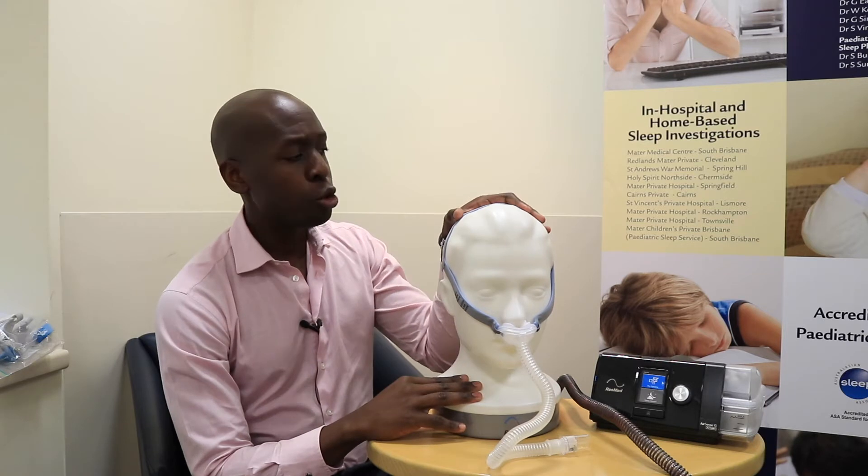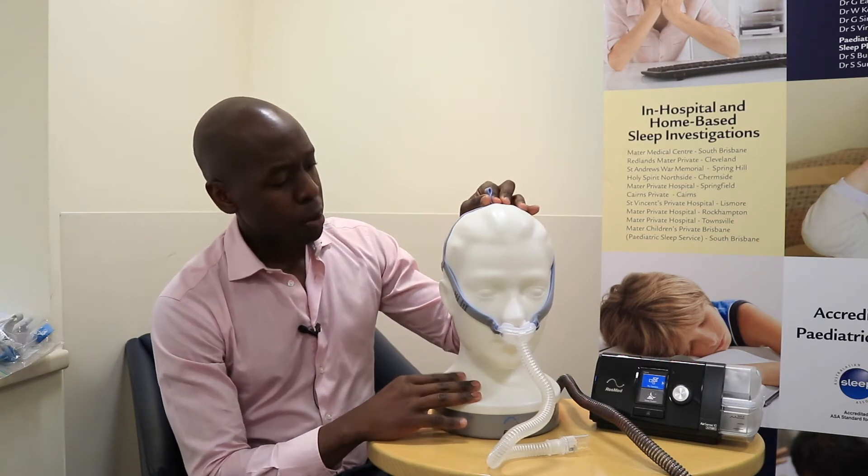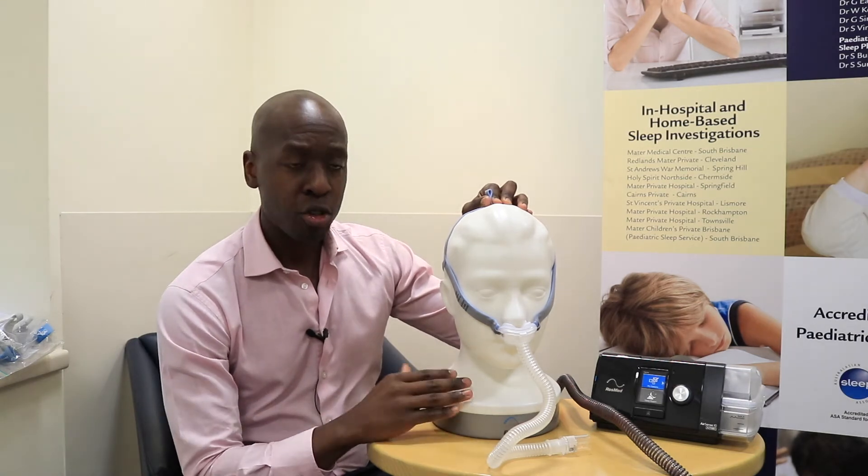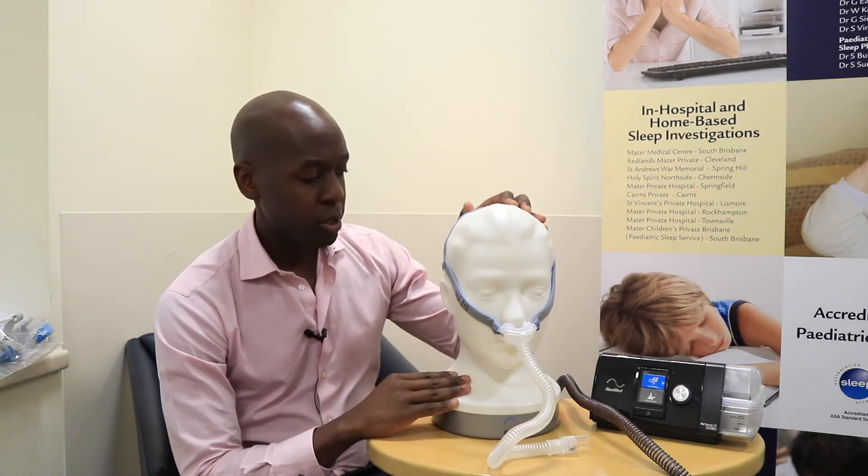By shortening the head strap you might just get a couple more months of usage out of that headgear before you have to replace it.